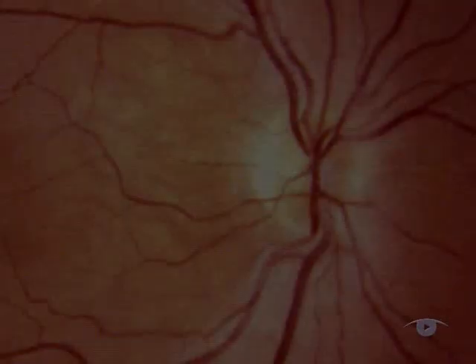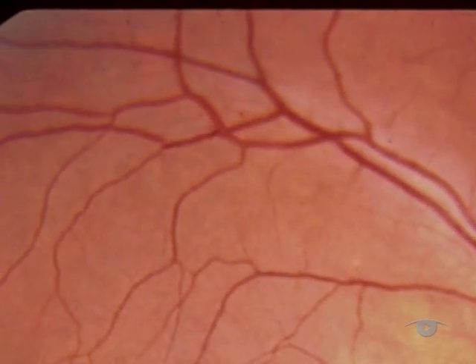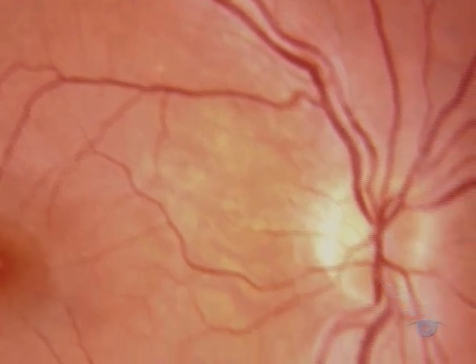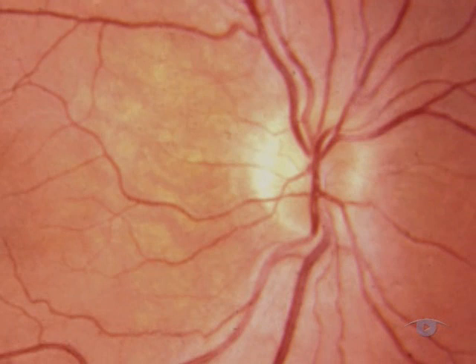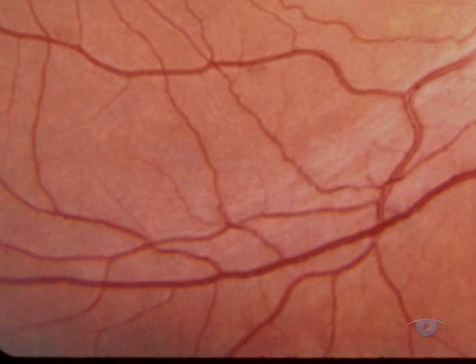Having examined the disc, go on now to look at the major blood vessels as they radiate out from it and form the four vascular arcades that supply the quadrants of the fundus. You can readily bring each area into view by asking the patient to look towards the quadrant that you want to examine. For example, looking up to the right brings the upper right quadrant into view. In order to examine both the lower quadrants, the lid has to be lifted up as the patient looks down.